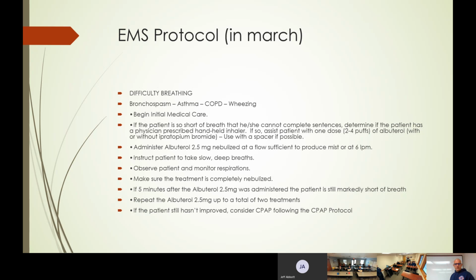All this is just a repeat of what we said earlier. So if we do all this, and again, for whatever reason, they gave me the presentation and it's backwards from what they're stating here, but if the nebulizer treatments don't work, you can move on to the CPAP. All right, we can try that. They did it the other way around in the presentation.